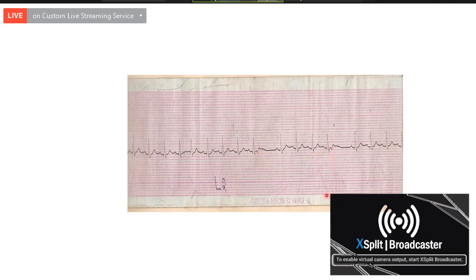There is an atrial ectopic which is quite early. You can see that it's very early. When there is a very early ectopic beat, when the beat reaches the AV node, it may find the AV node is refractory because of the previous beat. It is already in the refractory period, and the impulse cannot be conducted through the AV node. So when the impulse is not conducted through the AV node, we call it blocked atrial ectopics.